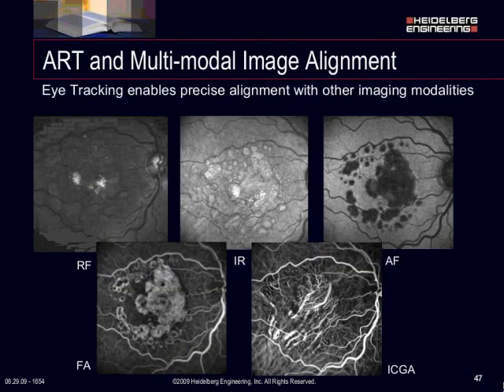So now, again, when you're taking OCTs with the new 5.1 software and the multimodality image alignment, if we take a picture, say of this particular patient, here are all 6 imaging modalities that the HRA OCT can do, right? You'll notice that each image looks slightly different. So if a patient came in the very first time and we did an ICG OCT, the patient comes back next time, we're not going to do an ICG, but we're going to do an infrared image, all right?